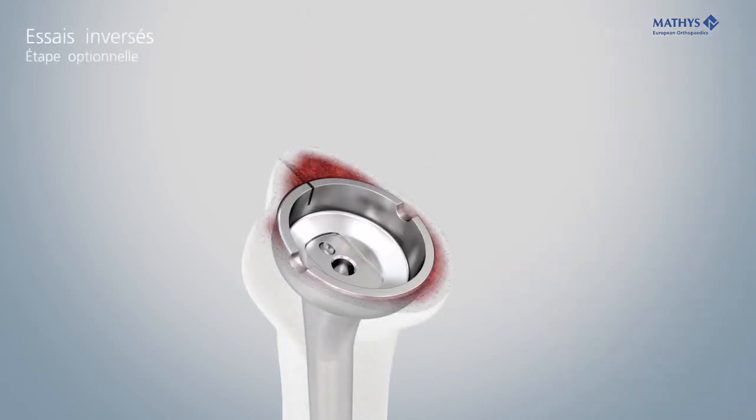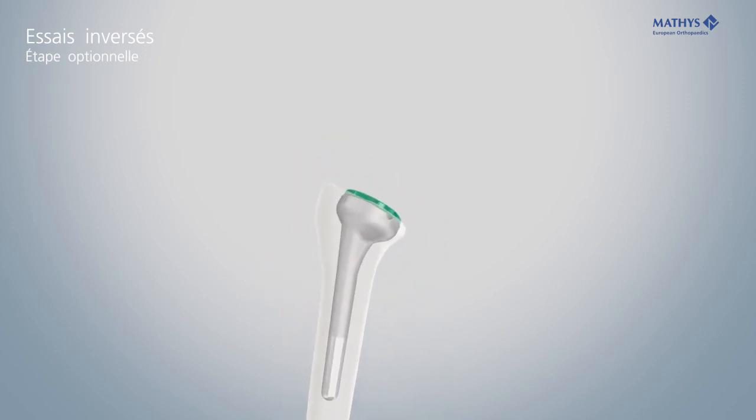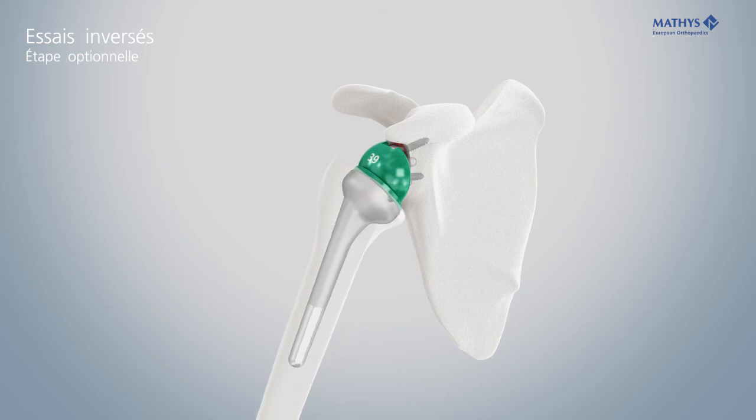Insert the trial inlay. Perform the reduction and verify the function.